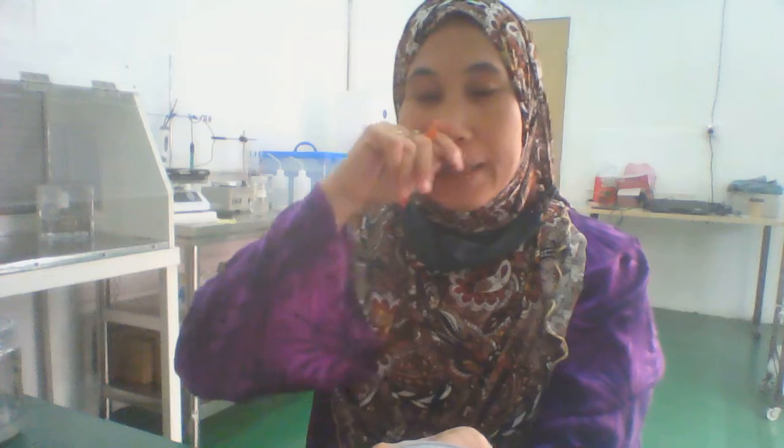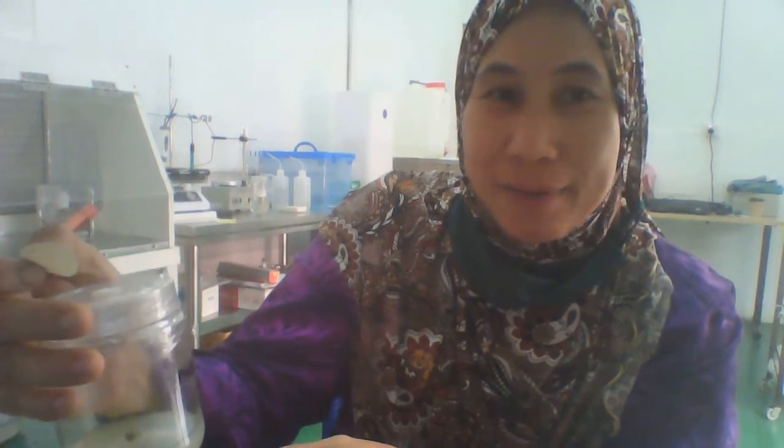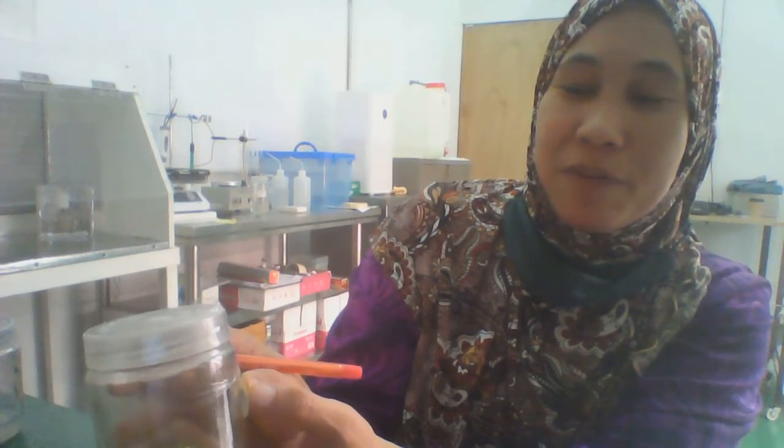This is my labeling structure. My labeling structure will consist of first the type of media that we use. For example, this one is M48, and M48 is actually our code, because sometimes you need to keep your media as a trade secret, so we put it this way. So we have a document where we elaborate what M48 consists of, but for this case you all know that it's actually MS plus 5BA.